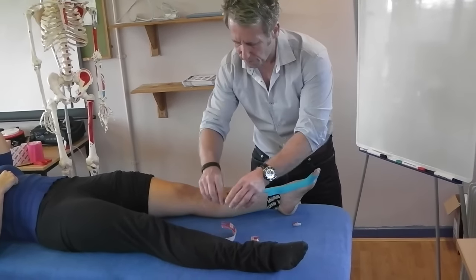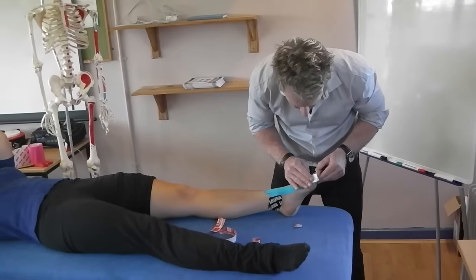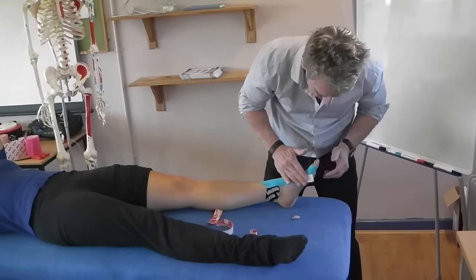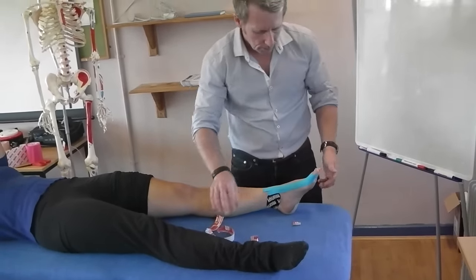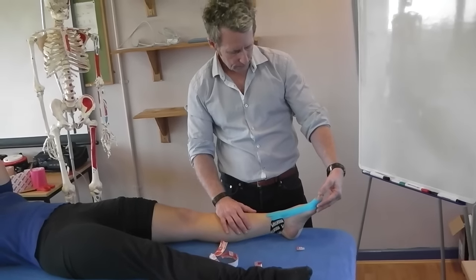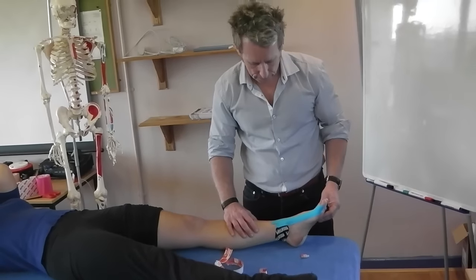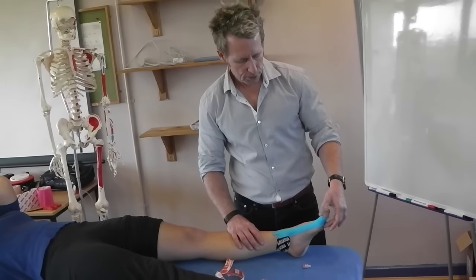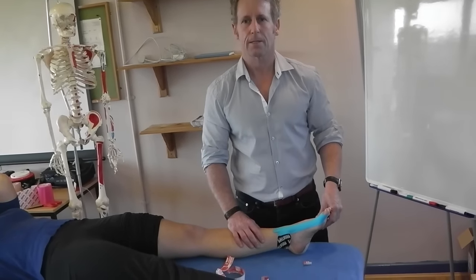Then we can just use the back of the tape for a few seconds just to heat activate. That will hopefully control the position of the hallux valgus. And that's kinesiology tape — using Rock Tape to control the position of the hallux.